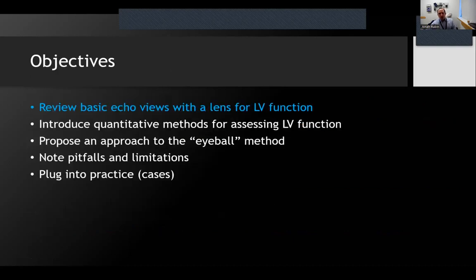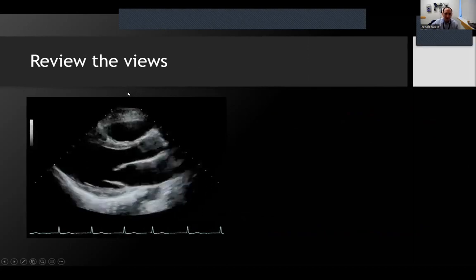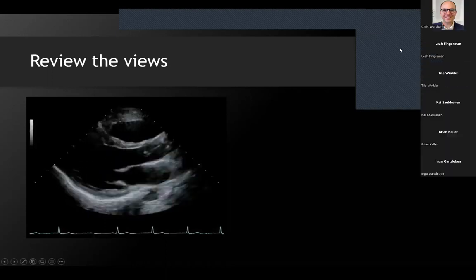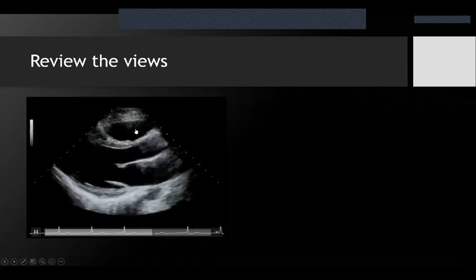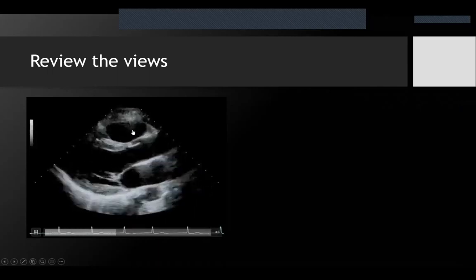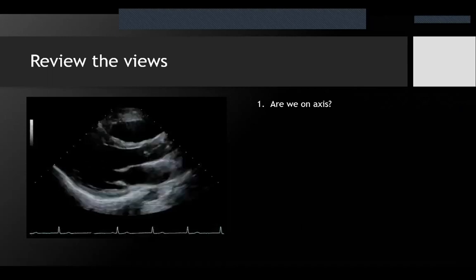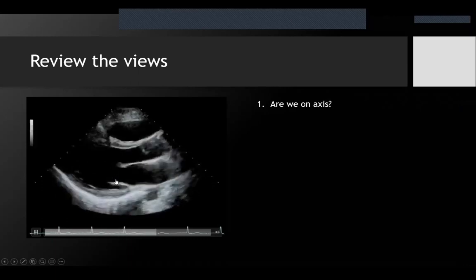So to jump right in, we're going to review some basic echo views with the lens of LV function. I'm going to ask if any of our fellows are willing to share what view we're looking at right now. Please, this is a safe space. Parasternal long. Thank you, yes, parasternal long. I'm not going to talk about how to get it, but the first thing you have to know whenever you're looking at a basic view is, are you even on axis? Before you start making interpretations, is this a good clip? So is anyone able to share with us how you know that this is on axis?